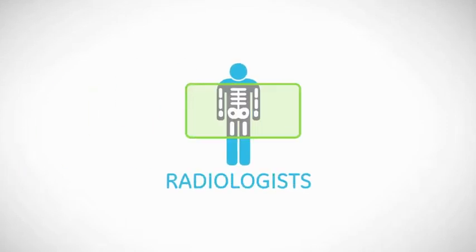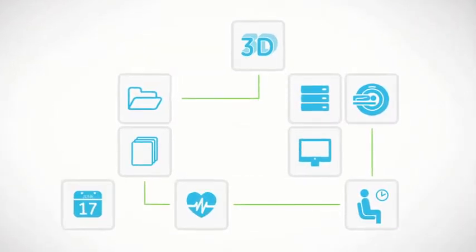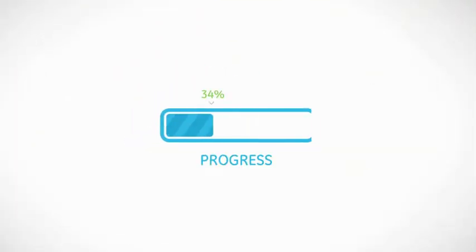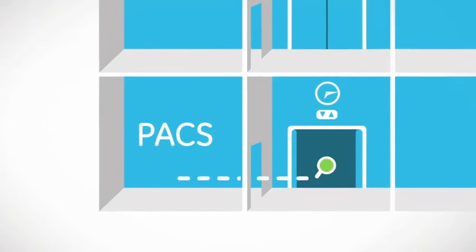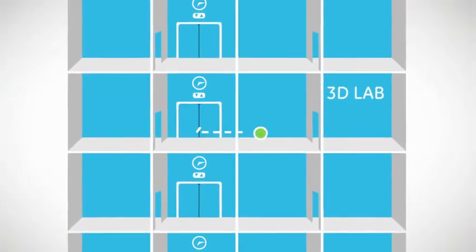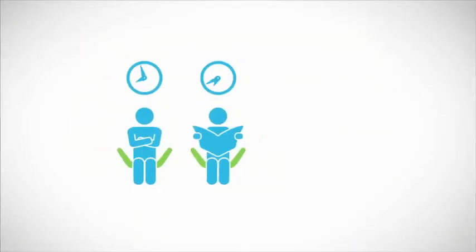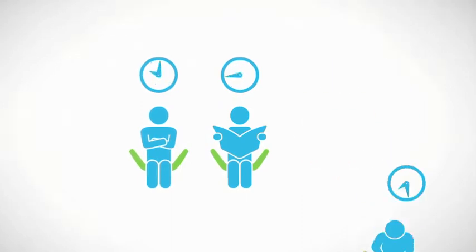One of the biggest challenges radiologists face is time. And an inefficient, disconnected workflow isn't helping. Technologists are bogged down by processing. Doctors and radiologists are inconvenienced by faraway imaging stations. And access is limited while everyone waits for images to transfer between these systems. Patients are left waiting, care suffers, and referrals drop.